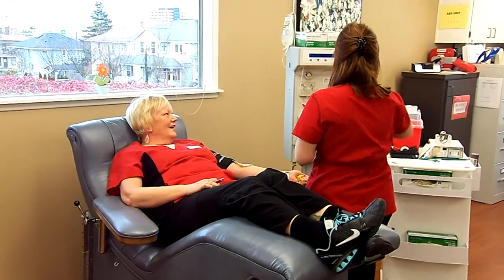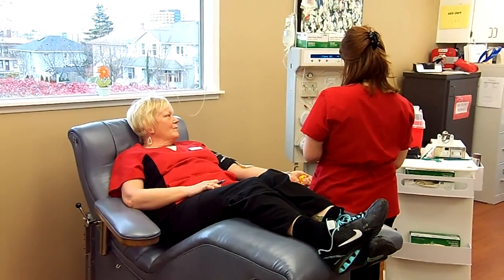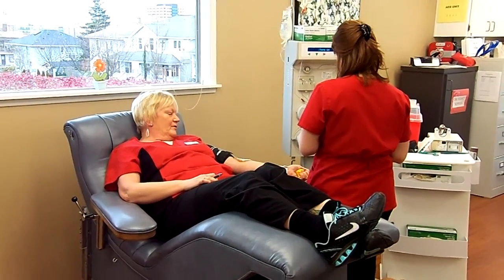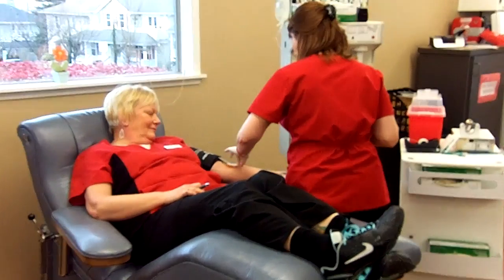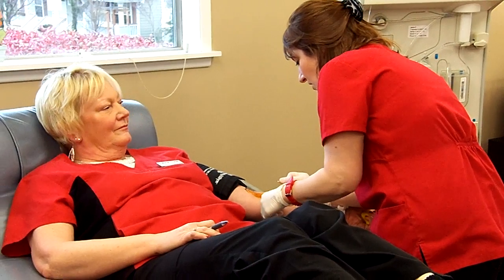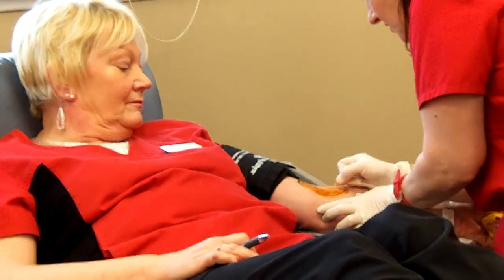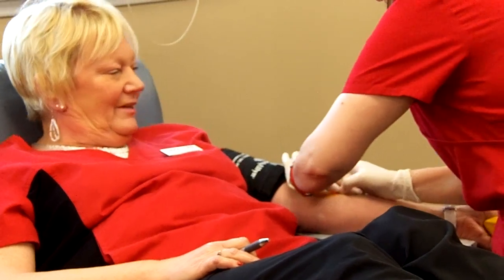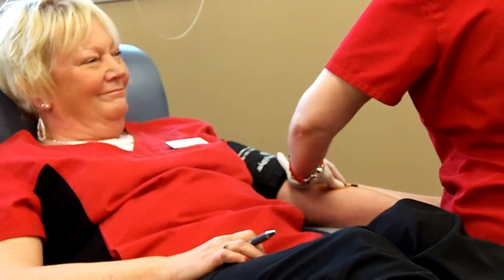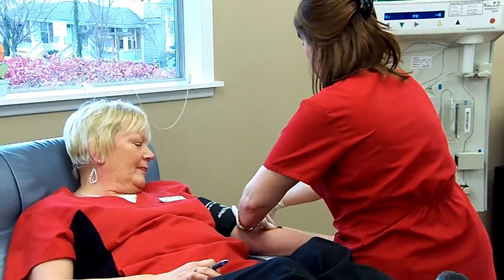Okay, here you're ready. So I'm going to go up just a little higher here. Go ahead — squeeze it, squeeze it, squeeze it. So right now you're going to move the cap, remove that, and you're going to go back to your area. It's a little hook. That was a good one. Relax your hand — at this point, relax your hand completely. You want to lower your pressure down before you proceed.